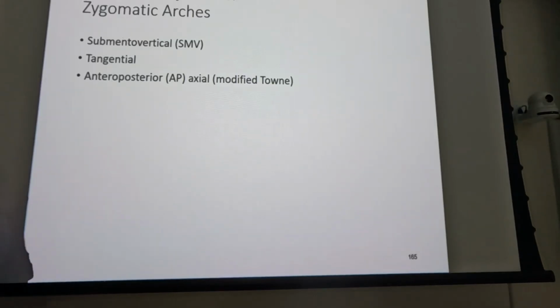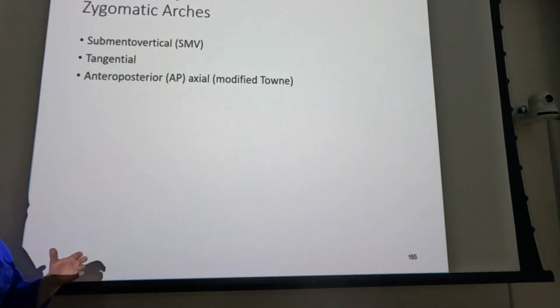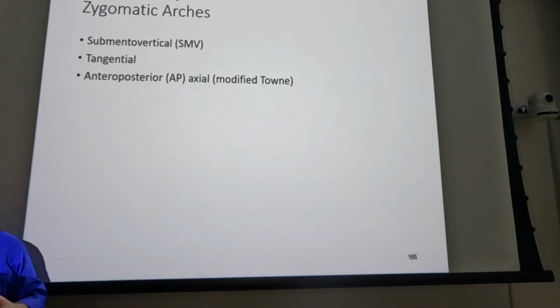The top of their head is kind of wide. And the problem with that is that if you do an SMV, you're going to project the zygomatic arches onto the parietal bones. You just can't see them. So it's one of the few exams that you might consider shooting at a lower SID. What happens when you have a lower SID?